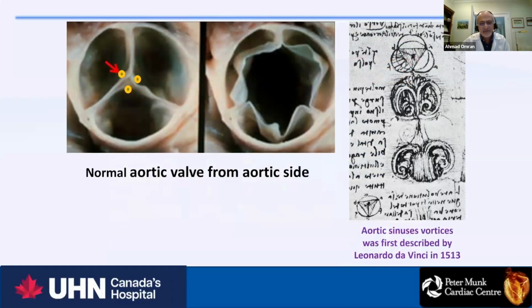This is the anatomy of the aortic valve, normal anatomy. Most of the time it is tri-leaflet. Also, 2% of the general population can be bicuspid. So we have three leaflets. They are unequal size. That's very important. They are not equal size. And they coapt. At the coaptation point, they have a nodule, called the nodule of Arantius. They coapt like 4 to 5 millimeters together. So it means we have a 4 to 5 millimeter coaptation line, the leaflets overlapping each other.